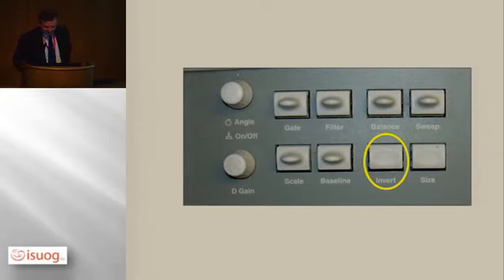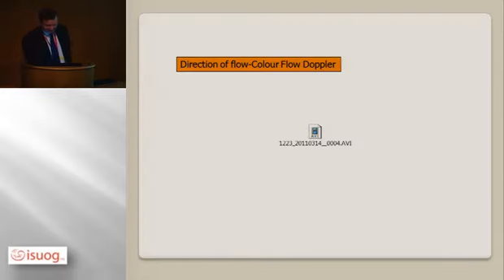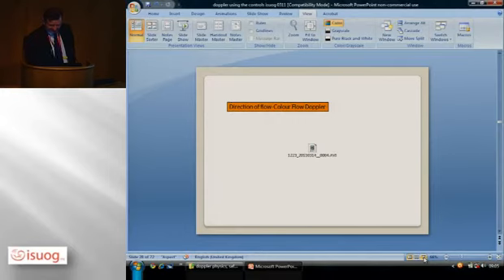The invert function, it's a button that is always there and a lot of people don't press, but someone who's particularly malevolent in your department might have pressed it. And it, of course, inverts the Doppler scale. It doesn't invert the image, it inverts the Doppler scale.